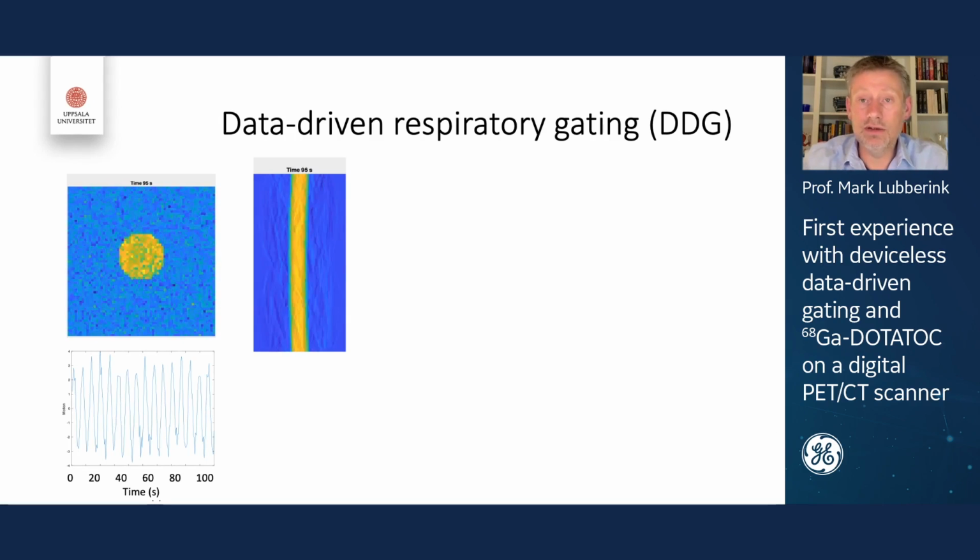Now, data-driven gating, as it is implemented now in GE's MotionFree, uses principal component analysis, and what that essentially does is that it divides up the sinogram into components that explain the different variations in the data.